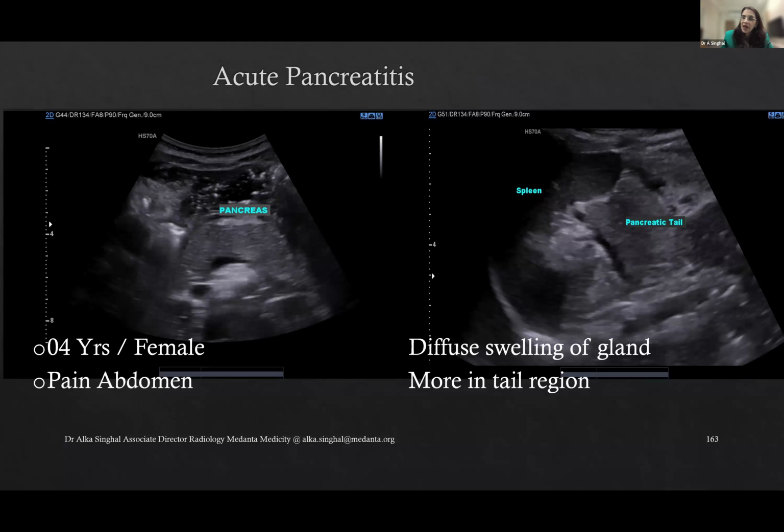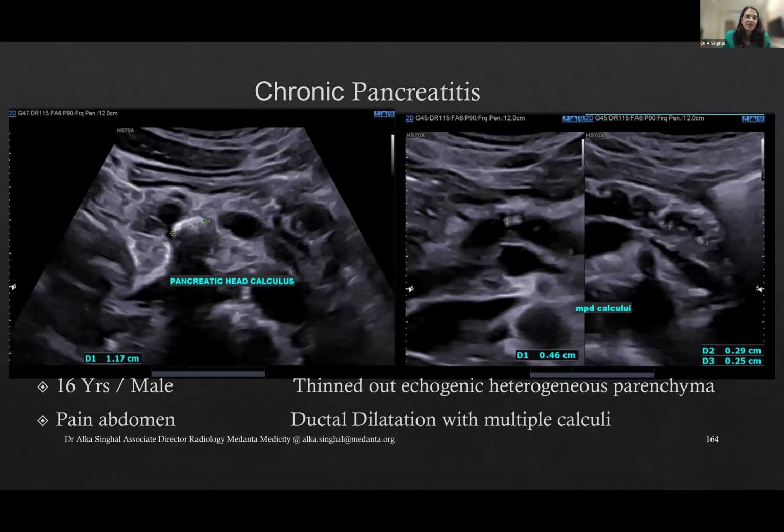To relearn abdominal ultrasound. Acute pancreatitis is very common across all ages, pediatrics or adults. And there is a big spectrum of ultrasound findings, right? You can have little changes just at the tip, at the hilum of the spleen and the pancreas. You can have pseudocysts, various presentations, and you can have patients with different body habitus, and it's very challenging. And of course, they will not go for repeat CTs or anything, and often maybe they are in the periphery where there is not much CT available, or you are the only one who has to give the diagnosis. So it is possible, and yes, we can do it.